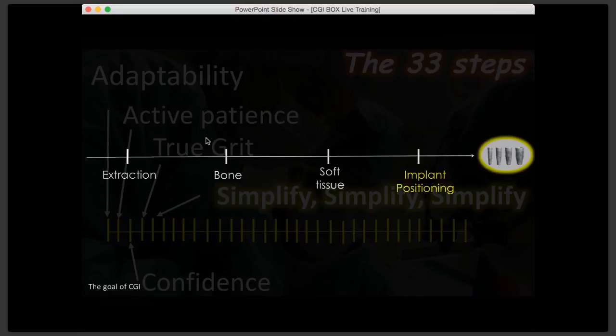Timing is important if you prefabricate a provisional. If you prefabricate, let's say, an implant temporary, and you didn't get the timing right, think about it. The temporary crown is only going to fit one way. Now, if you got the timing wrong, the crown will not fit the guided surgery. And I showed you in IGR number 3, if you want to check it out, aesthetic zone, these timing notches and how timing is super critical in that fit.